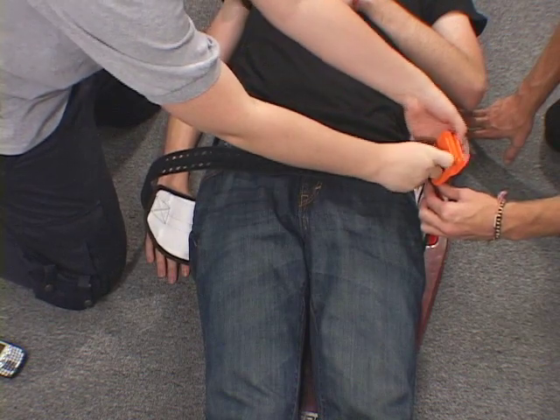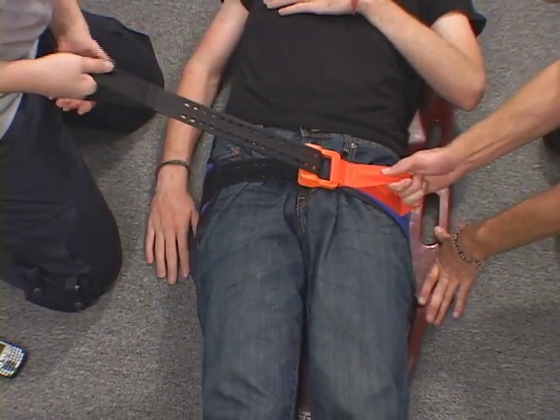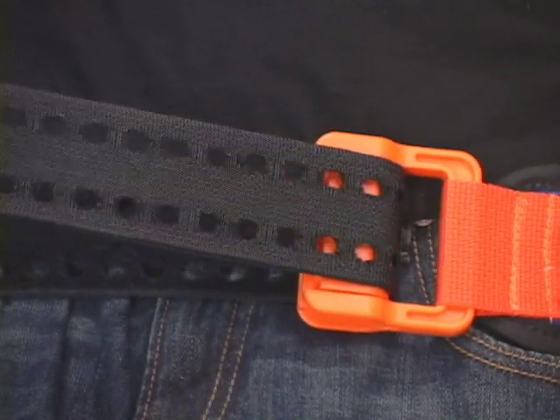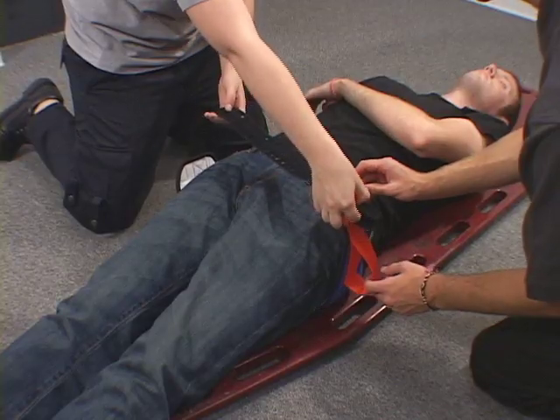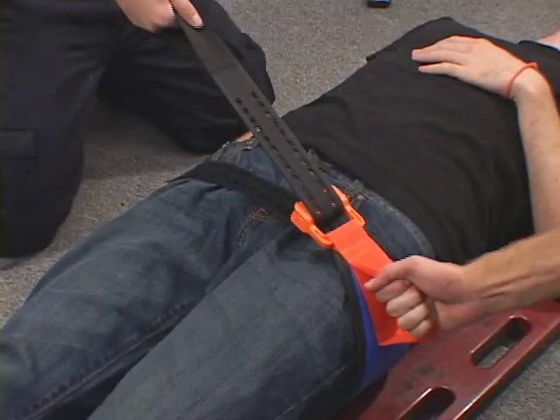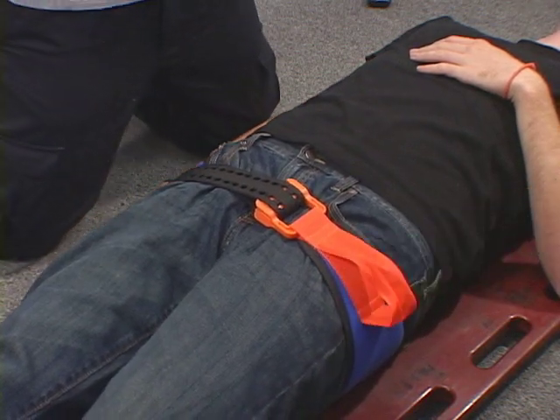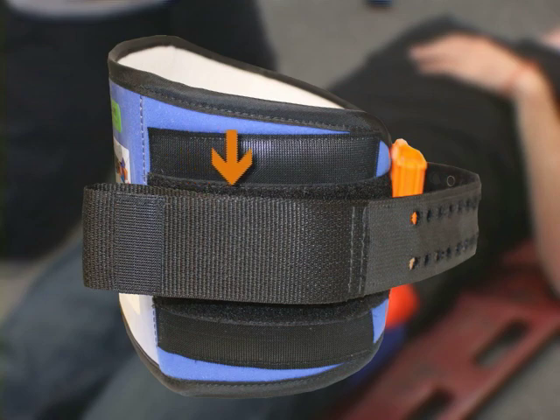Next, insert the webbing through the buckle. Then grasp the fixed pull handle on the other side of the belt and pull the two handles in opposite directions. Pull until you hear or feel the buckle click, or the belt stops. When you determine that the buckle has engaged, do not release tension. Maintain tension and firmly press the free pull handle against the belt. The velcro hooks on the surface of the free pull handle will secure it in place.